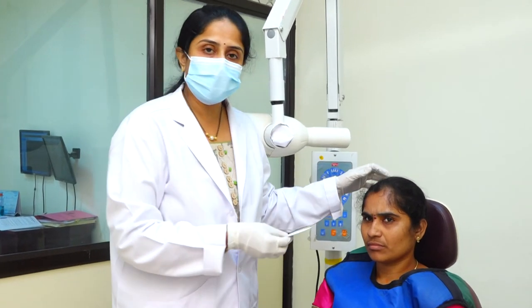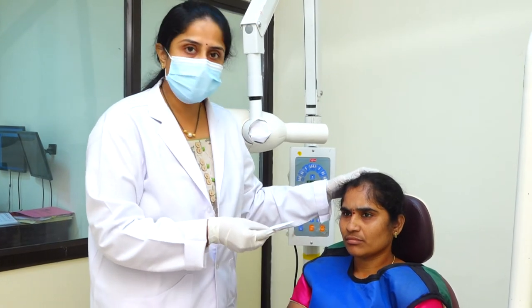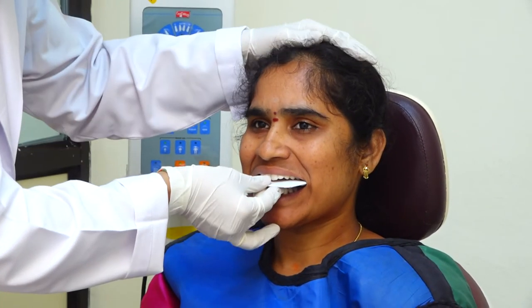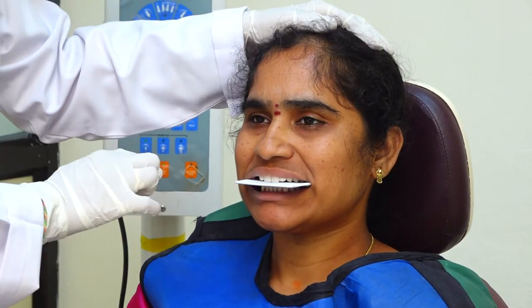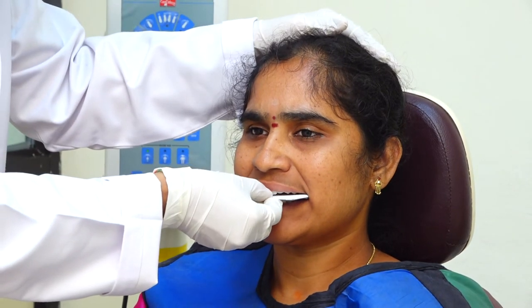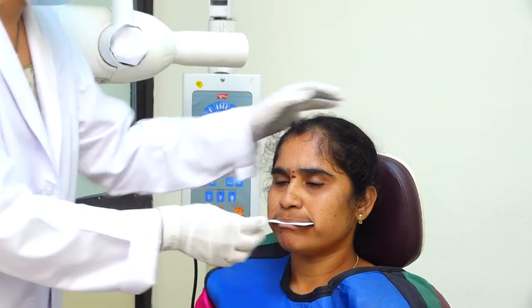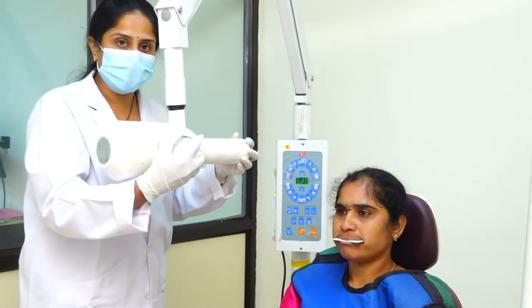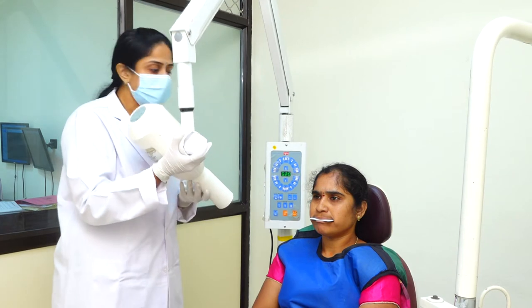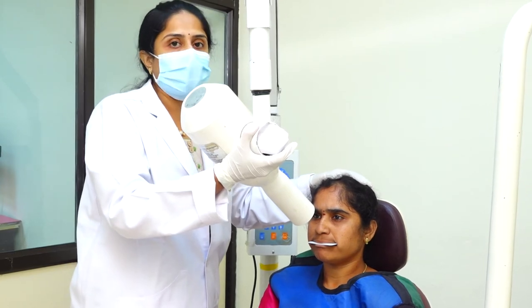First, I am taking the maxillary anterior radiograph, which covers from canine to canine. Ask the patient to open his or her mouth and place your occlusal film so that the long axis of the film is perpendicular to the sagittal plane. The posterior border of the film should touch the ramus. Ask the patient to close the lips and arrange your angulation — for the maxillary anterior radiograph the angulation should be plus 45 degrees. The central ray should pass through the tip of the nose.